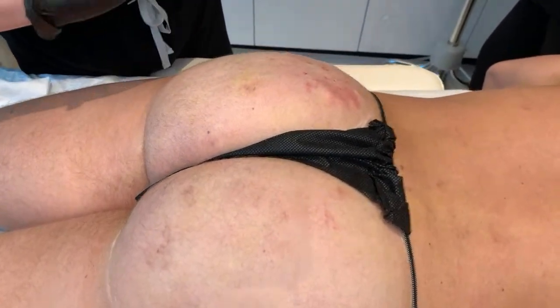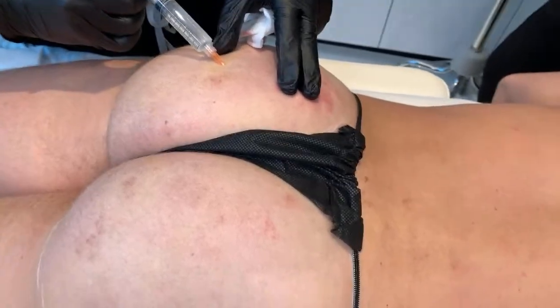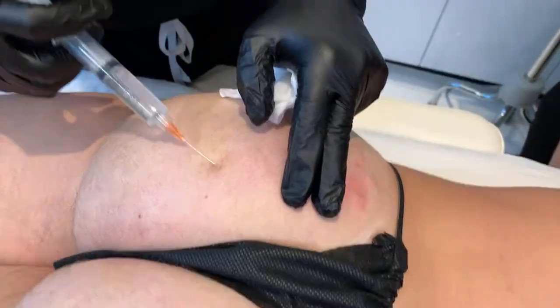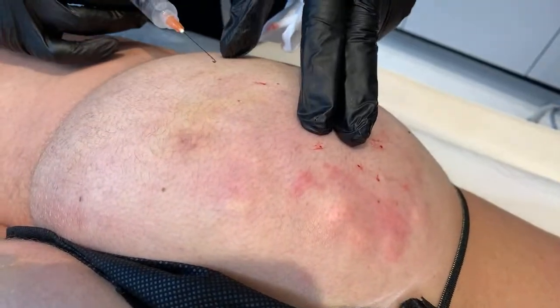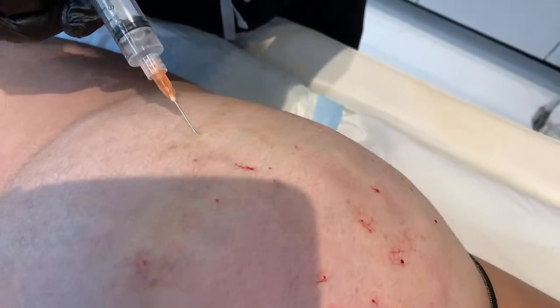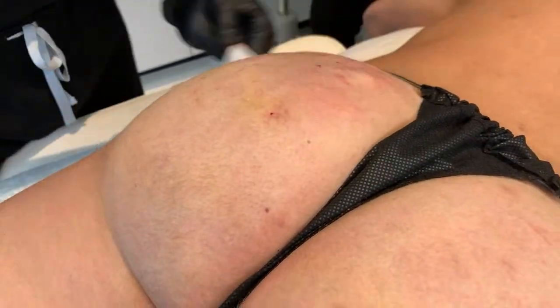Okay, a lot of people are asking this. We had quite a few questions related to this. How many syringes or how many units are you doing for this result? Remember, there's no units with SCULPTRA. And again, this isn't for a result. This is for a boost. This is the soccer butt boost. So we're doing 8 vials today. And I think it's just good. You just keep building from there. Most guys that do the fat grafting, I have them do 4 per side every few months while they're healing.